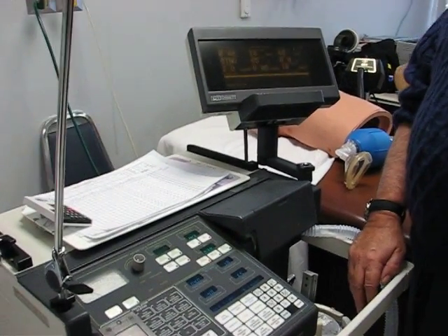I would say now I need to order a stat chest x-ray for ET tube placement, and in 30 minutes we need to get an ABG. And all right. That's the end of the procedure.